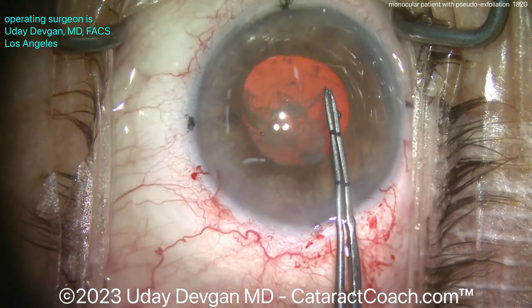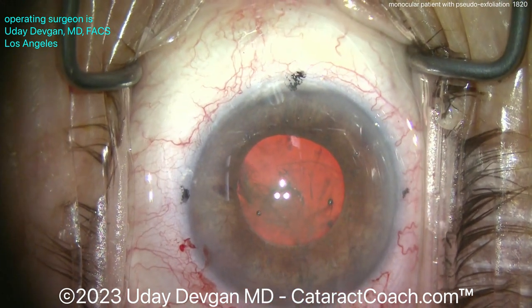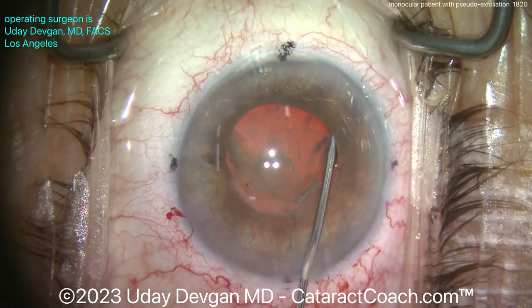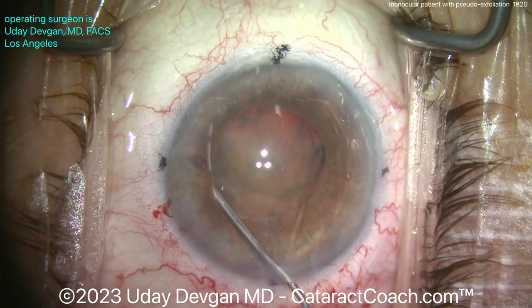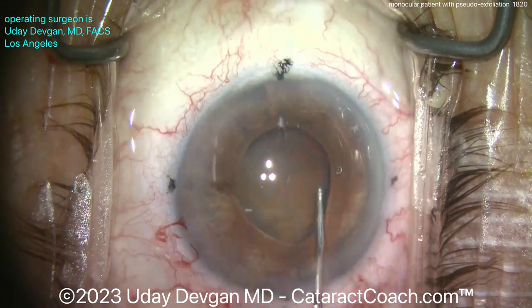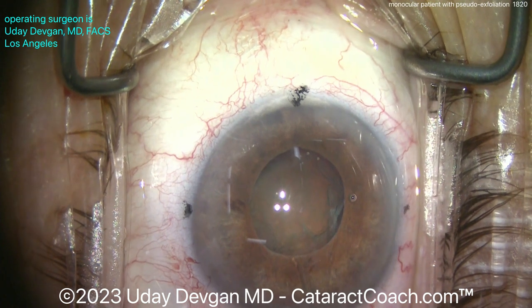For nucleus removal, the viscomydriasis is just temporary — as we take out viscoelastic, that pupil is going to come down a little bit. My approach is iris plane phaco. I want the iris to hold the nucleus as I do the chopping; that keeps the pupil expanded, keeps the iris away from me, and allows me to continue. Getting a little bit of hydrodissection, nice and easy. Notice how we also lose viscoelastic coming out of the eye. The nucleus is now partially out of the bag but still under the iris — I want to lift it up more.